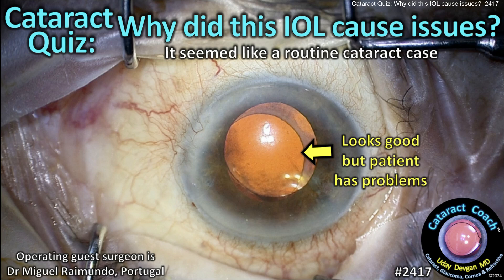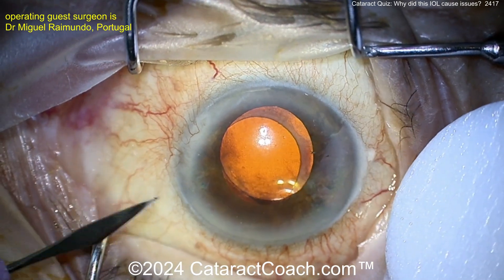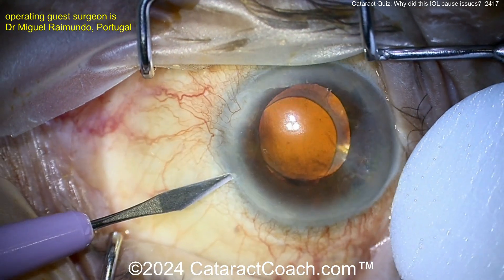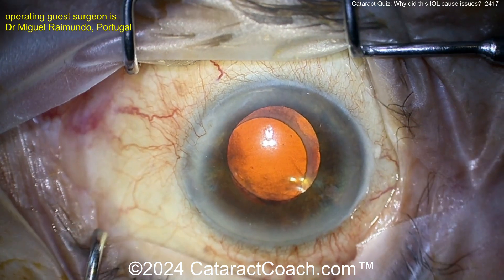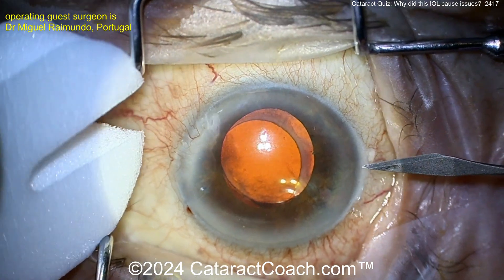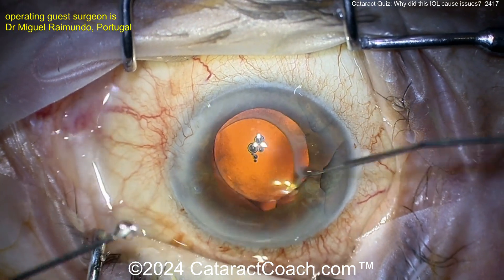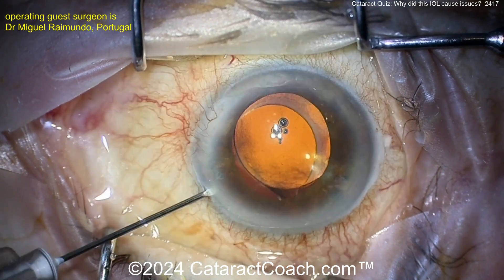Cataractcoach.com presents a cataract quiz: why did this IOL cause issues? It seemed like a routine case. Look carefully — this patient has UGH syndrome: uveitis, glaucoma, hyphema, a lot of problems, iris translumination defects. But why? The patient had cataract surgery and everyone thought it was just a routine case. The operating surgeon said everything went normally.